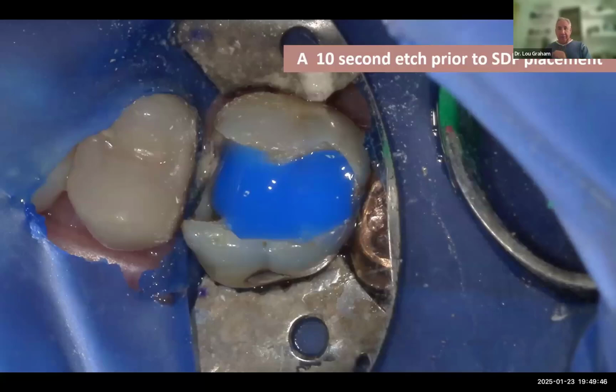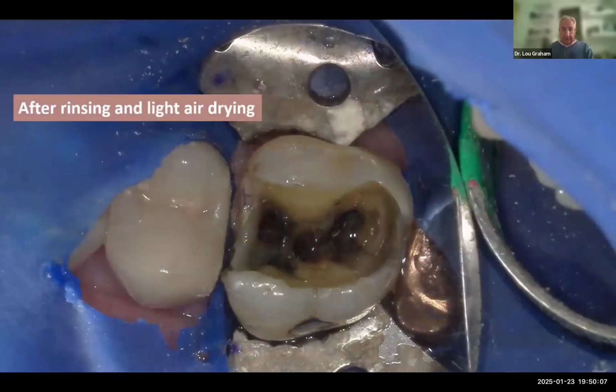So before I place silver diamine fluoride, I follow the literature and I etch for 10 seconds. So here's a pause for everybody. I want you to look. I'm etching before I'm placing the SDF. I'm removing the smear layer, probably opening up some tubules to allow better SDF penetration. So after etching for 10 seconds, I'll rinse and lightly dry.